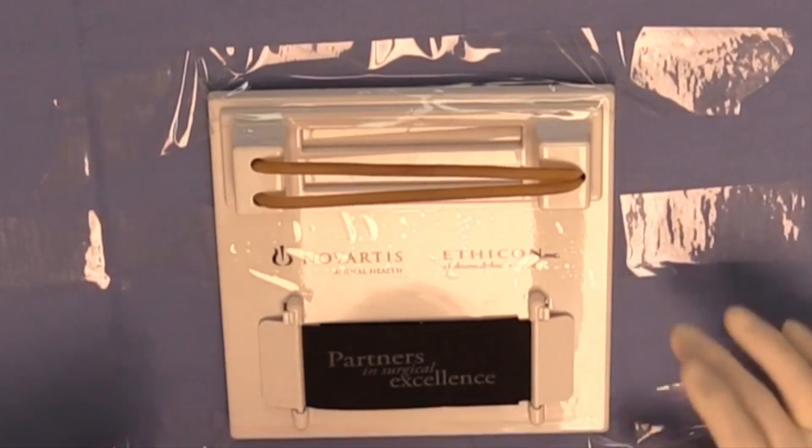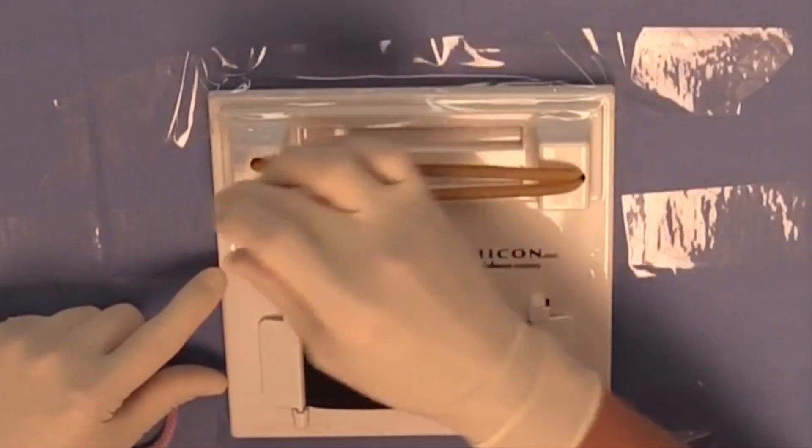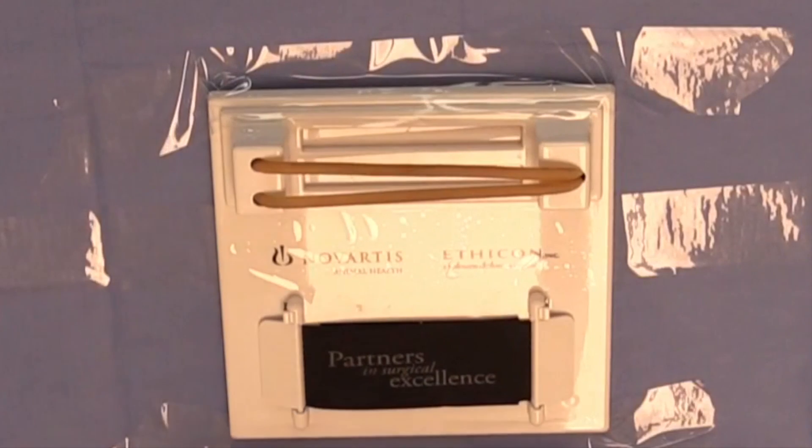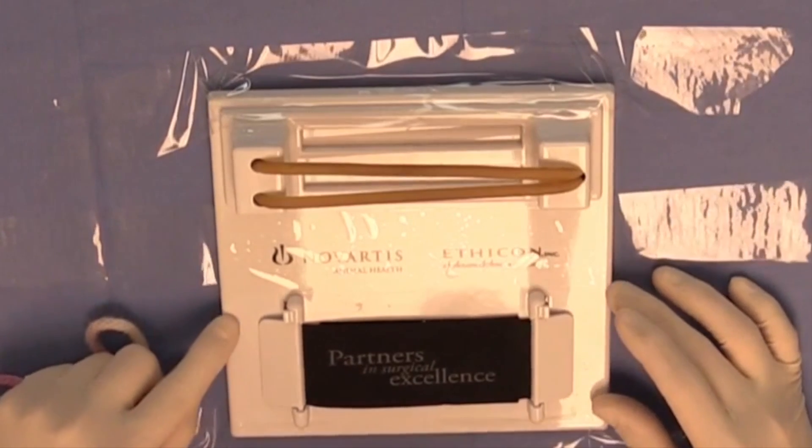You can see that I have the Knot Board oriented so these silastic tubes are going sort of transverse to my orientation or my axis, and this is generally the way that you're going to orient the Knot Board to practice your hand ties.